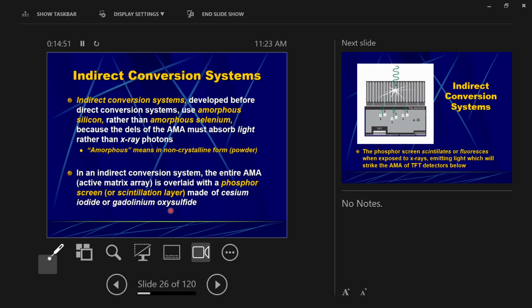We've always been converting X-rays to visible light to expose our imaging plates, even when they were film. It's just that this indirect conversion now converts X-rays to visible light to electricity instead of exposing a piece of film. So we've been using conversions from X-rays to visible light since pretty much the beginning.